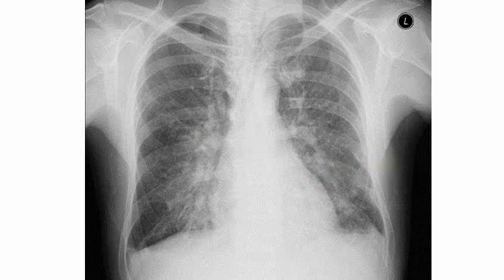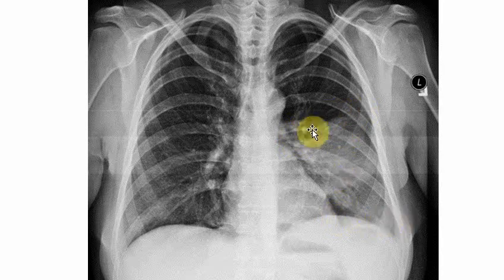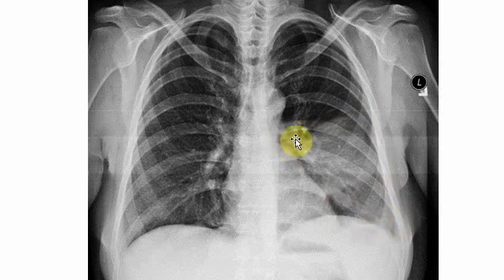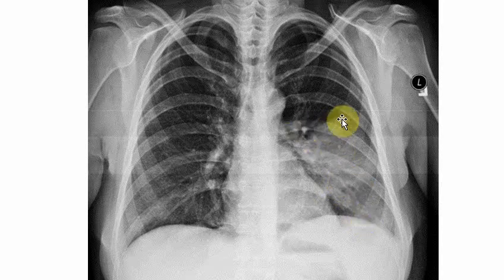The next picture shows a normal right side of the lung, but on the left side there is a very obvious consolidation — one big, confluent, homogeneous consolidation with an air bronchogram visible. It looks almost like the whole lobe is consolidated. This turned out to be lobar pneumonia. In bronchopneumonia you have patchy opacities, while in lobar pneumonia you have a big homogeneous consolidation.